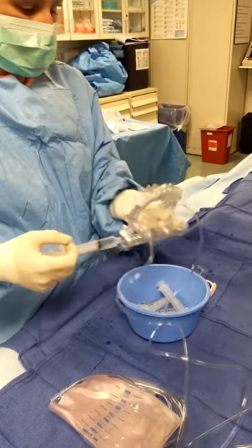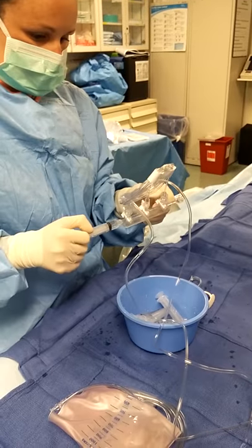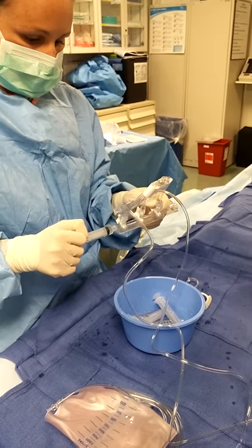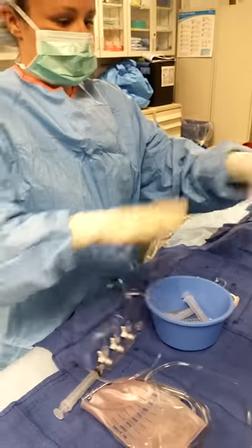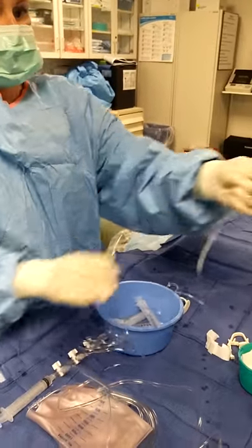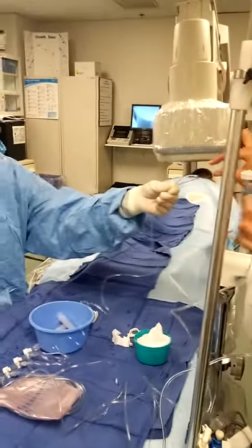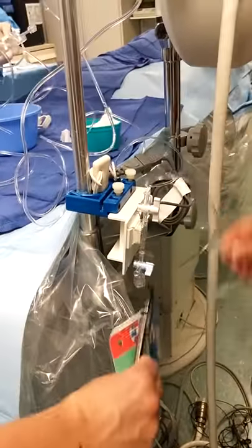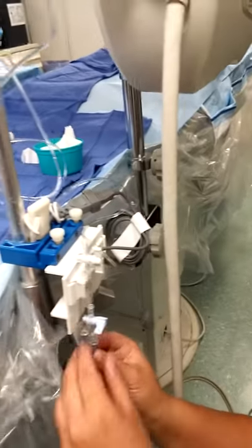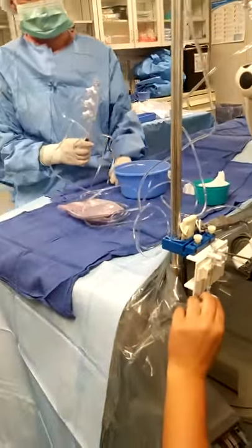My goal is to be handing her that pressure line by the time she's finished with that contrast. I'm drawing back heparinized saline. Pick it up off so that she can put it in.